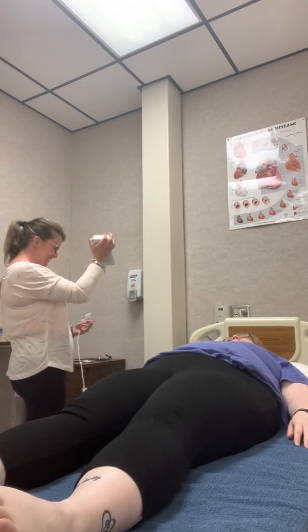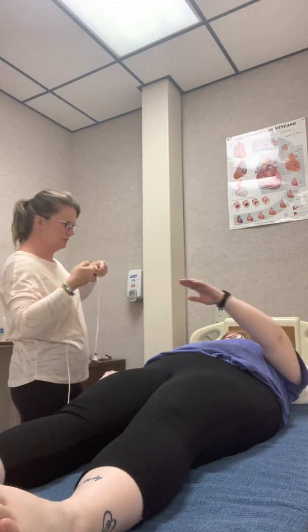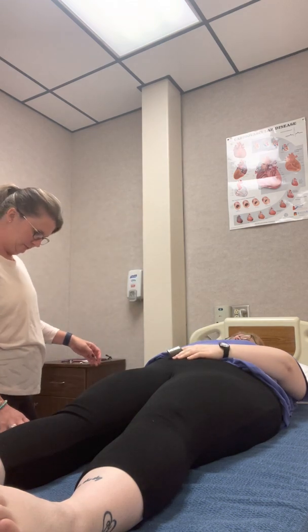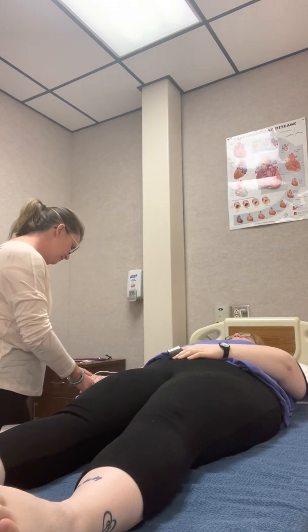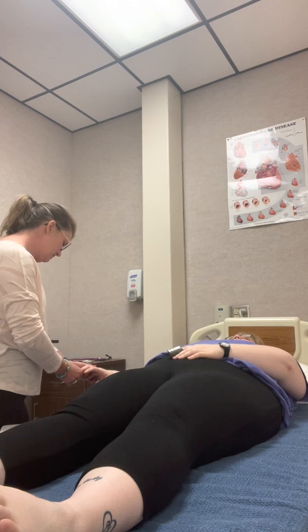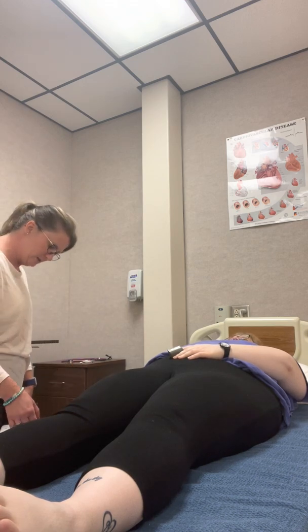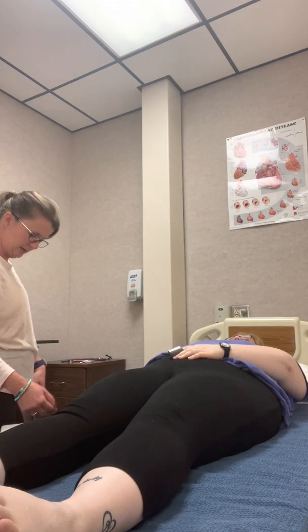Next thing I'm going to do is check your O2 saturation. Use that hand. Perfect. Alright, you can go ahead and rest your hand down for me. And I'm going to take a look at your conjunctiva. I'm also going to check your capillary refill here while I'm here, make sure that all looks good. That looks perfect. Everything is refilling like it should be, which means you've got good circulation going to your hands. Good. O2 saturation very good at 98 and your pulse is at 70.